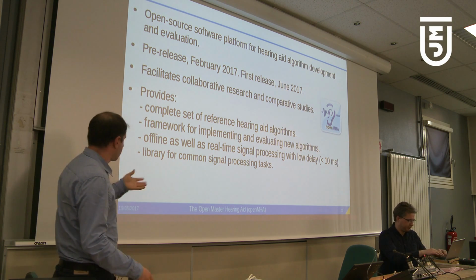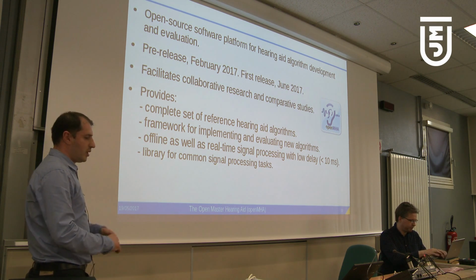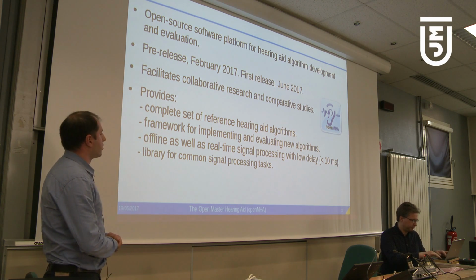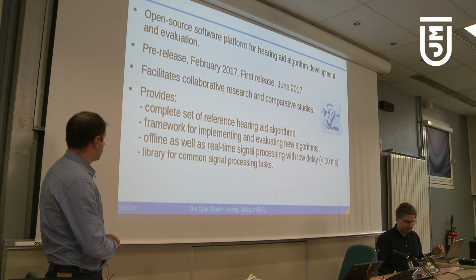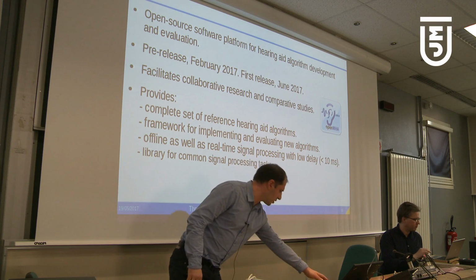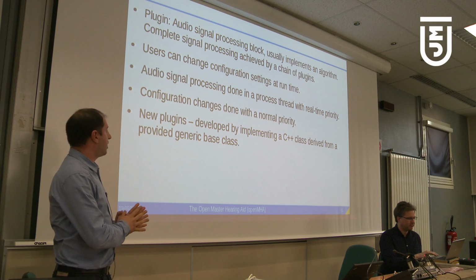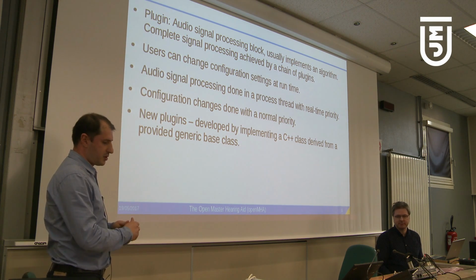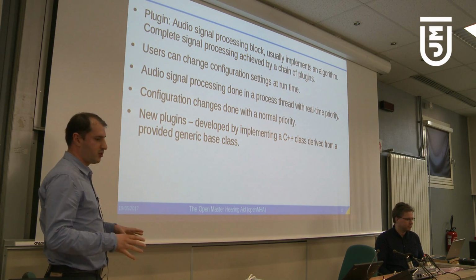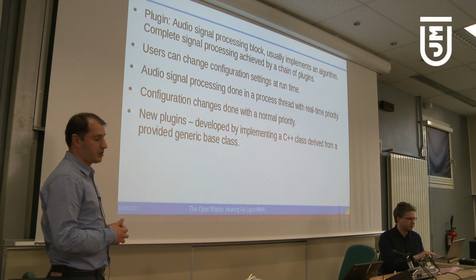And since, as I hope is clear, this involves real-time signal processing, low delay is crucial. So this platform should really ensure that this is the case. And of course, we also provide a common library tool for signal processing as well. So again, the idea is that this is an open source platform where researchers can collaborate and contribute.